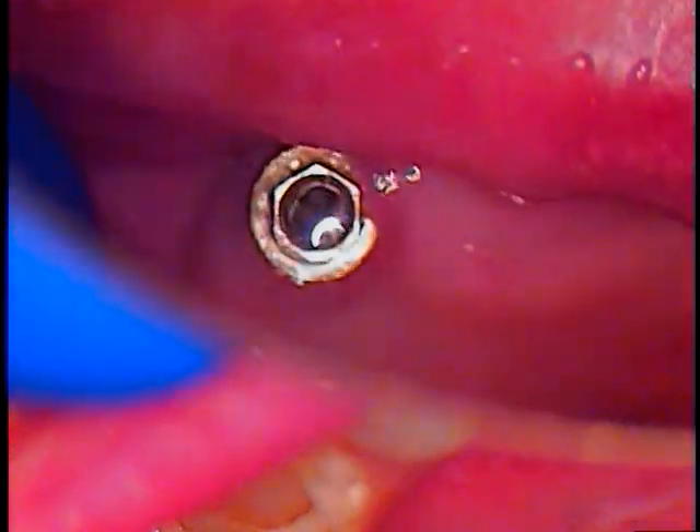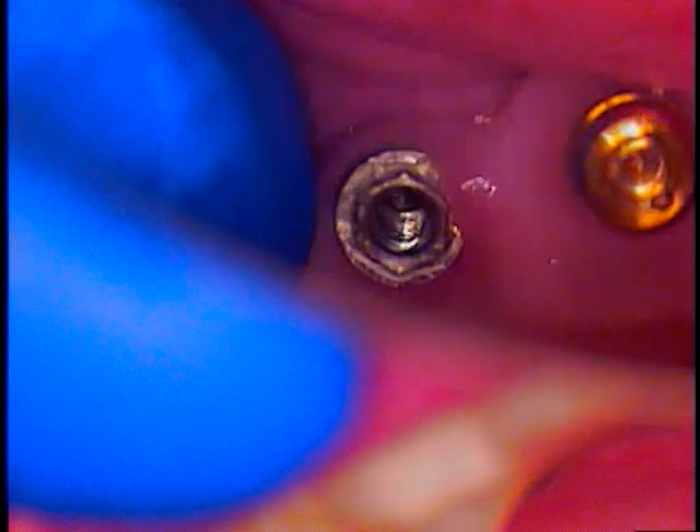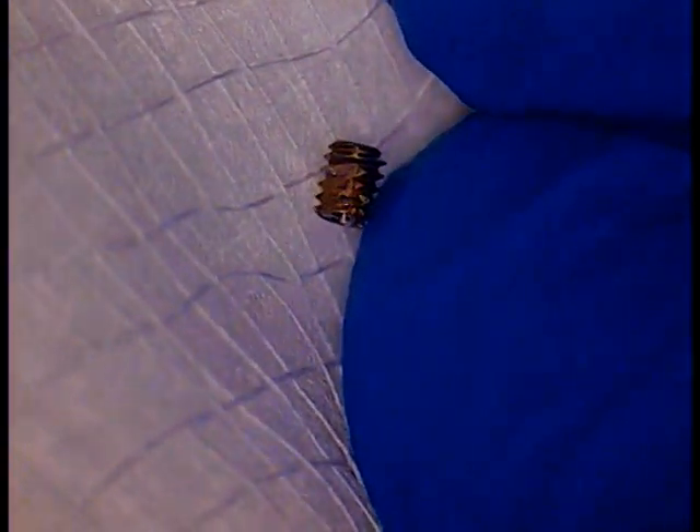We got the fragment out using the Cavitron tip. Let me just dry this off. You can see the threads here — I have it on a 2x2 gauze — but this is the actual screw itself. And you can see the entire side of the threads on this screw.